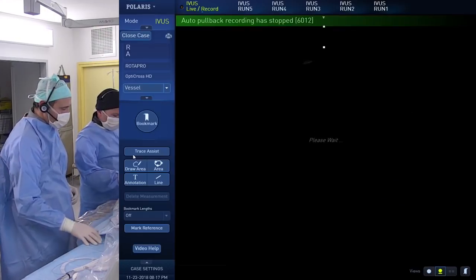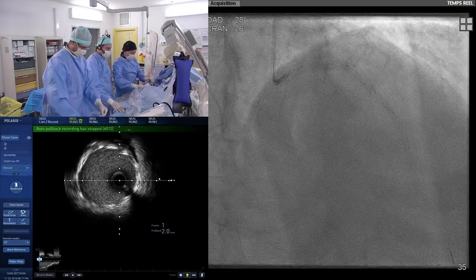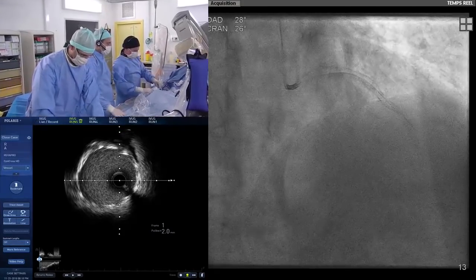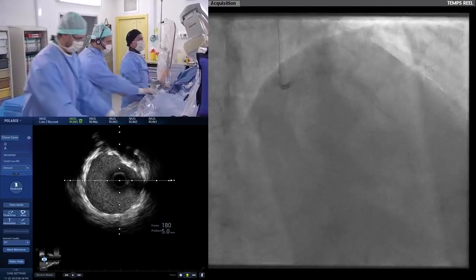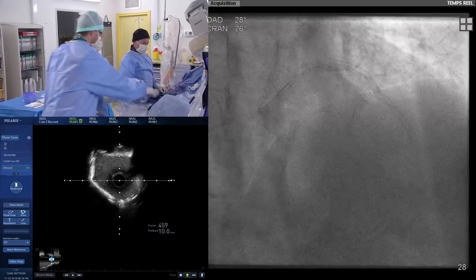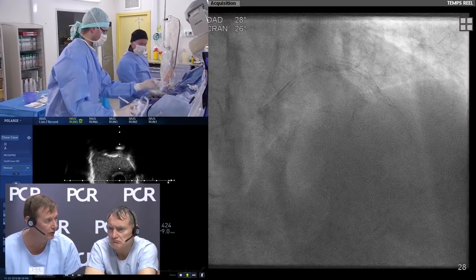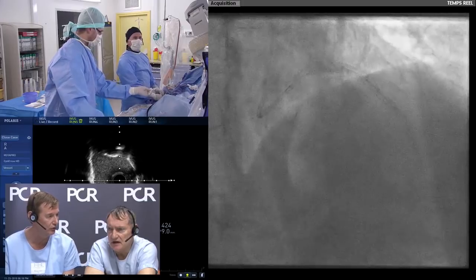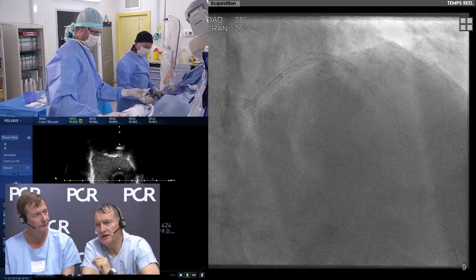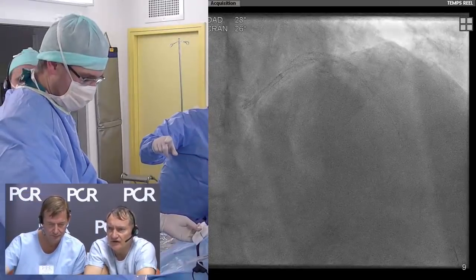So just to be sure, are you okay if we don't manage the circumflex artery? I mean, we don't do any kissing, or is it okay for that? There's quite a lot of trial data showing that you've got TIMI 3 flow with no restriction to the circumflex. It looked like a very good angiographic result. You wouldn't go after that. In my mind, I prefer to stop because after you have a difference of caliber, I just want to assess the size of the LAD and left circumflex.